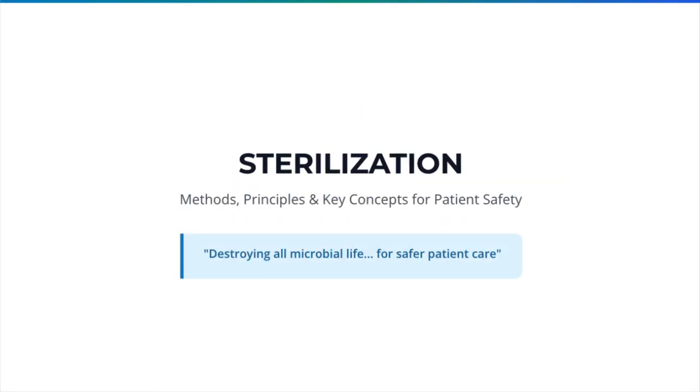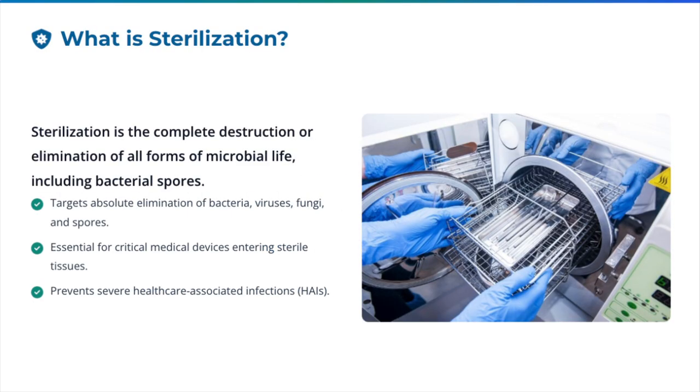Welcome to this video on sterilization, covering the essential methods, principles, and key concepts necessary for ensuring patient safety. Sterilization is the complete destruction or elimination of all forms of microbial life, including bacterial spores. It is an essential process for medical devices that enter sterile tissues, helping to prevent severe healthcare-associated infections.